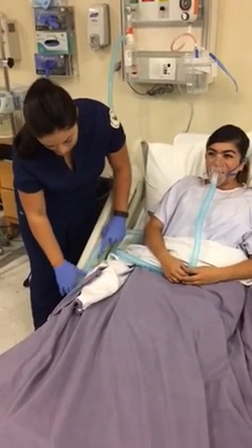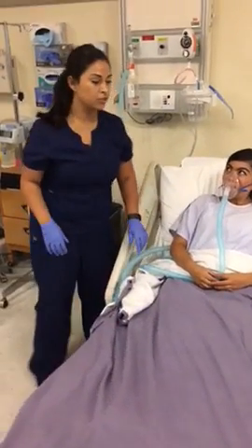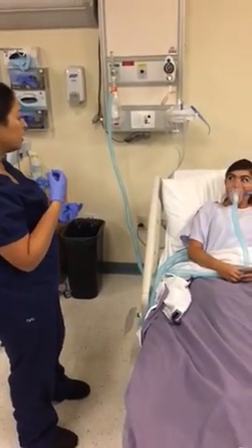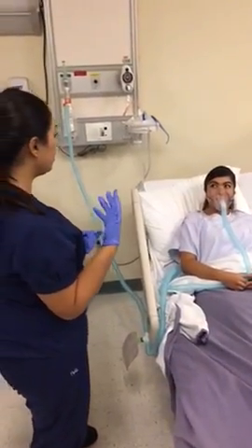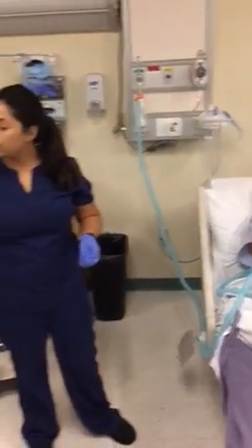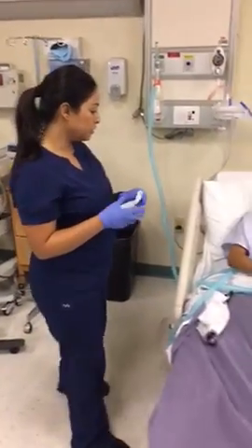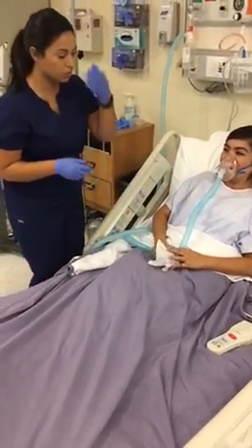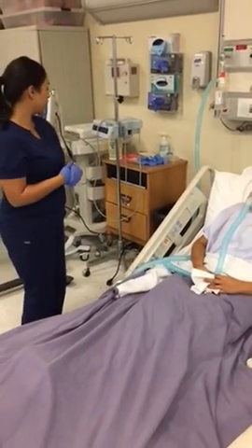It should take a couple minutes, maybe around 15, to really feel the effect. It should release some of that swelling again, and you might start coughing up a little bit of secretions. I'm going to give you this little napkin in case you have to. Thank you, Briana. You're welcome. You can just remove the mask and spit into there if you need to.